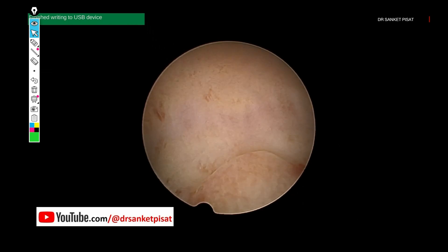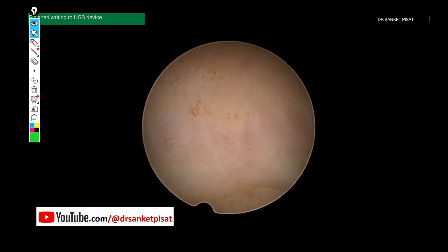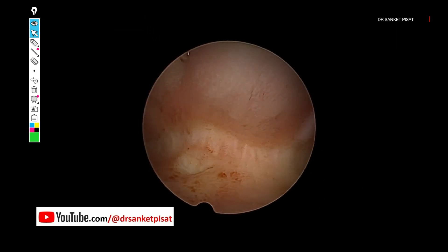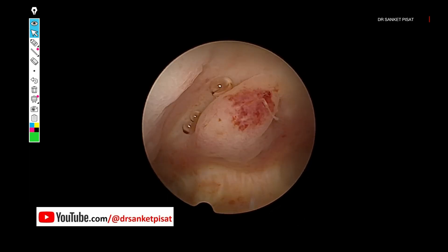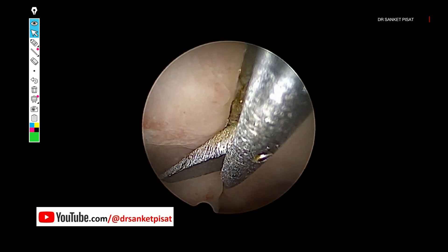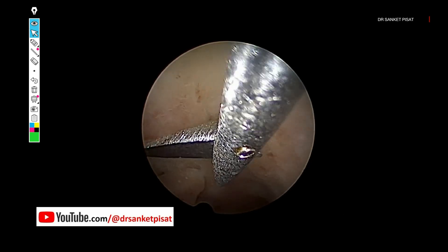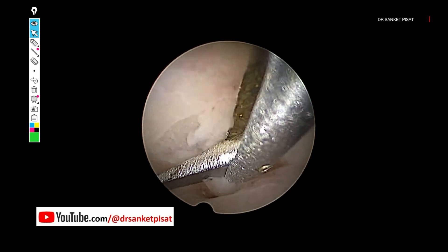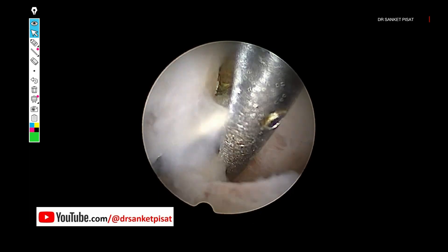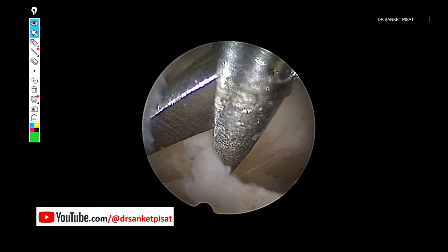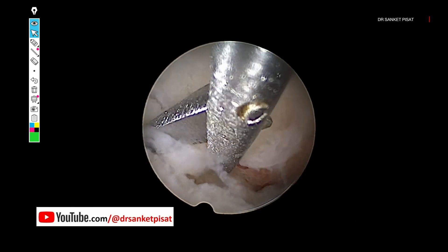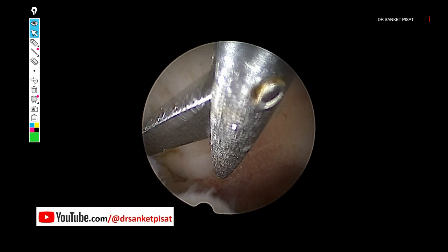Since the size of the septum is not very large — some may even argue it is an arcuate uterus — we are going to choose to do this entire surgery using only a hysteroscopic scissor. The advantage of using a hysteroscopic scissor is that there is no collateral damage to any of the surrounding endometrium and the cuts given are extremely controlled. Some authors argue there may be recurrence with a scissor, but the trick is to keep the dissection very close to the uterine wall.